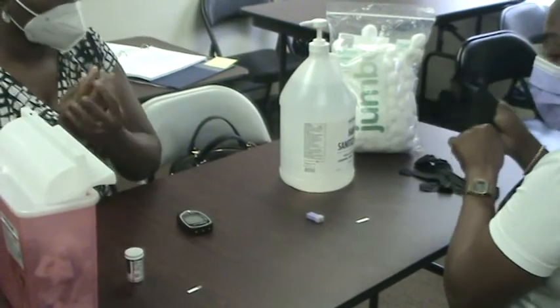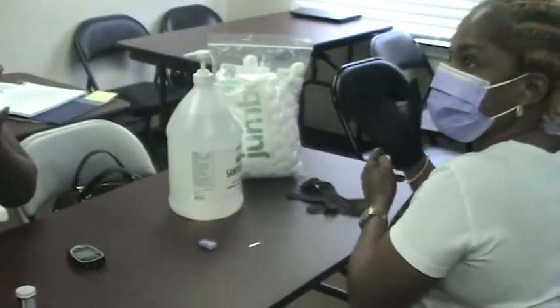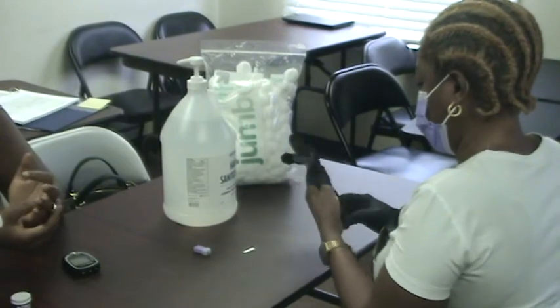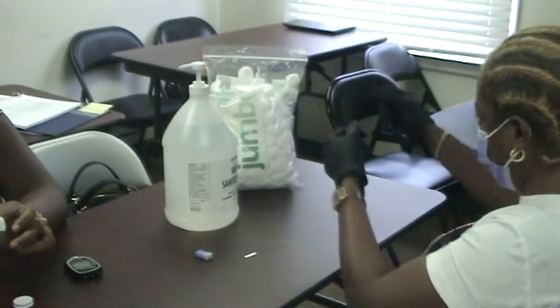Is my blood sugar fine? You ate before you came? Yes. But it's fine. Normal range is like 80 to like 120. Give and take, depending on the individual.